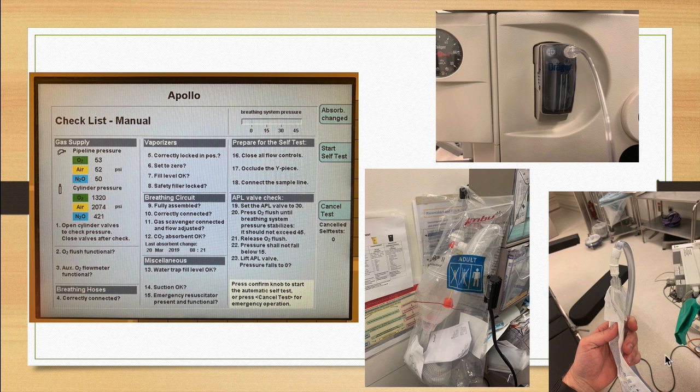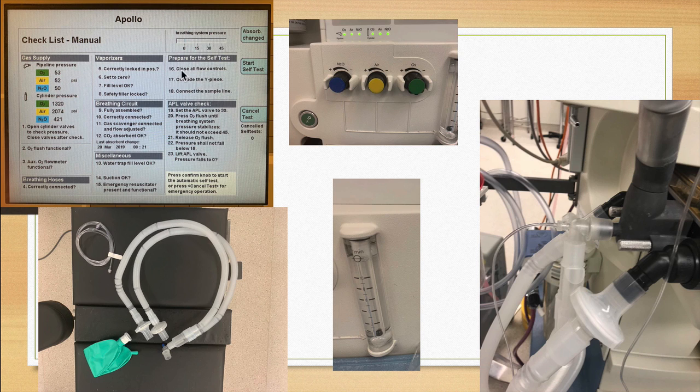14 asks you if the suction's okay, and we'll go in ad nauseum about how important suction is in just a moment since it's part of our MSMAIDS acronym. 15 is asking us about our emergency resuscitator being present, and of course it's referencing the Ambu bag, which at our facility usually either hangs on the back of the anesthesia machine or in this case on the side of the Pyxis.